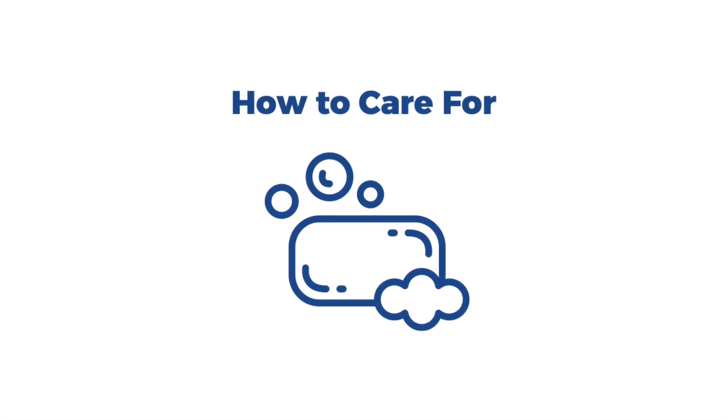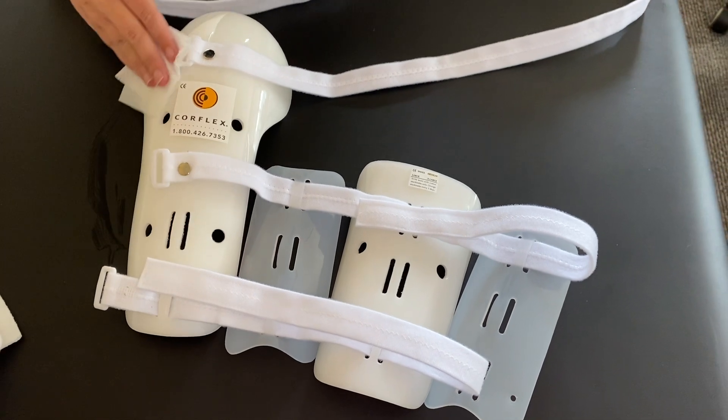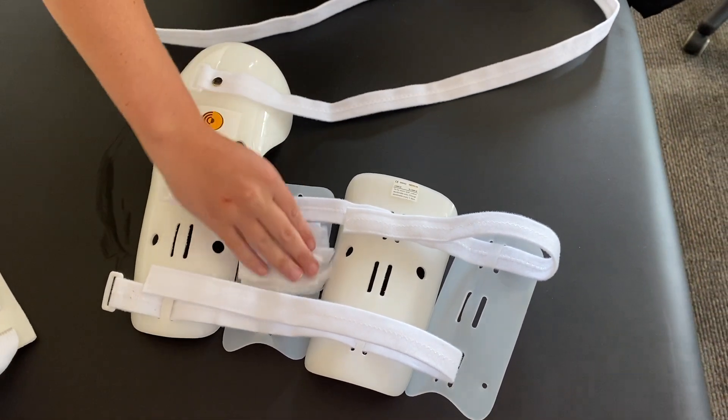To care for your humeral splint, it is best to clean by hand with mild soap and a damp cloth. Be sure to dry thoroughly before reapplying.